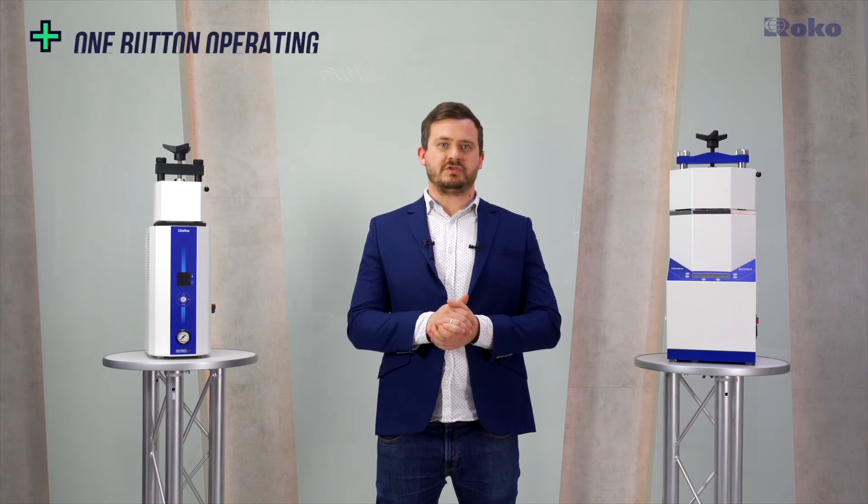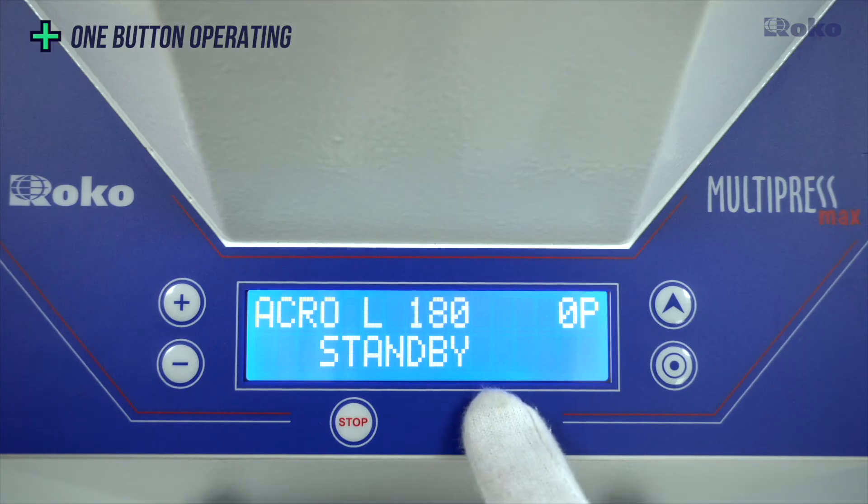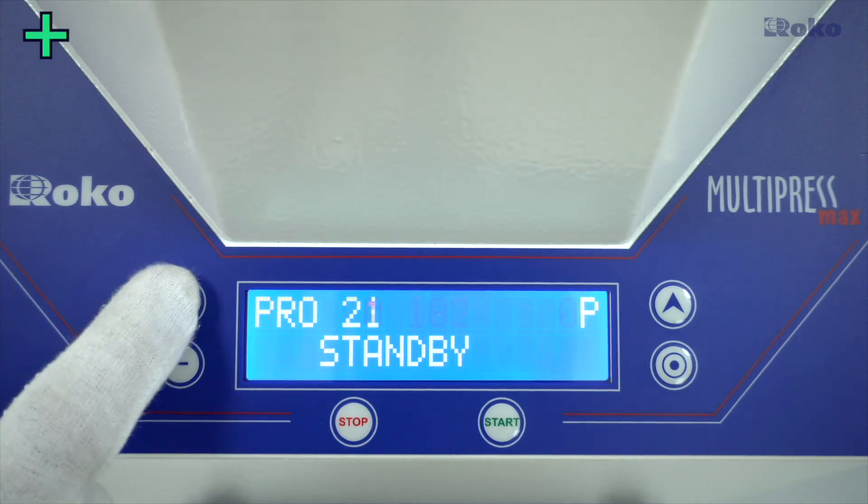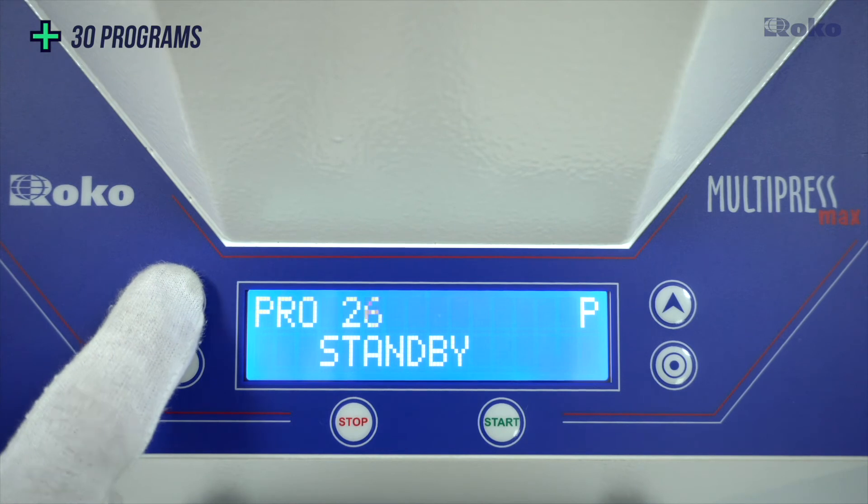Multipress handling is reduced to a minimum. In everyday use, it is limited to the use of just one button. You can choose from 30 programs and operation of the device is fully automatic.